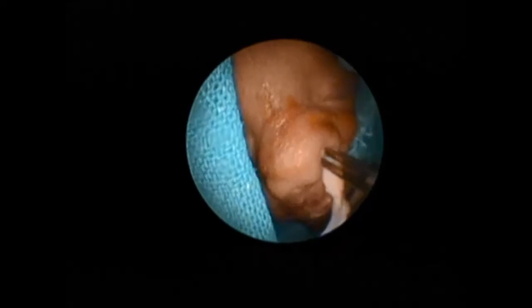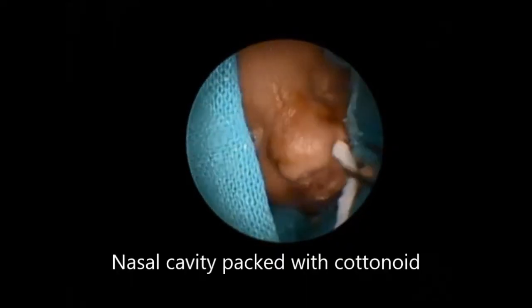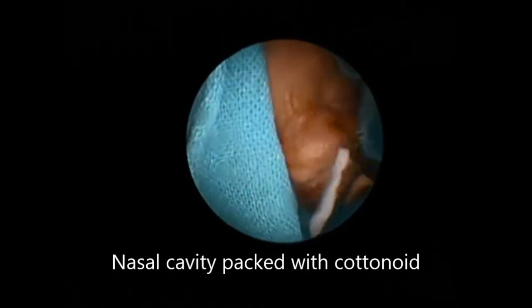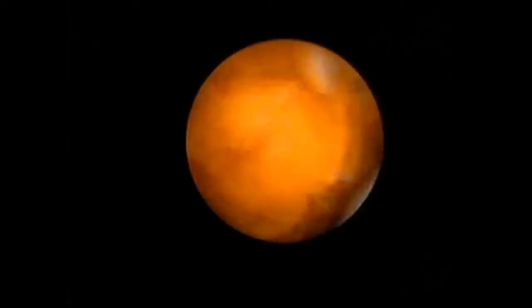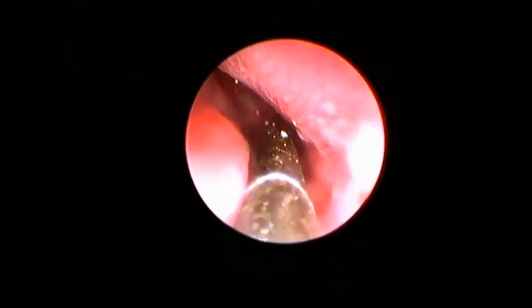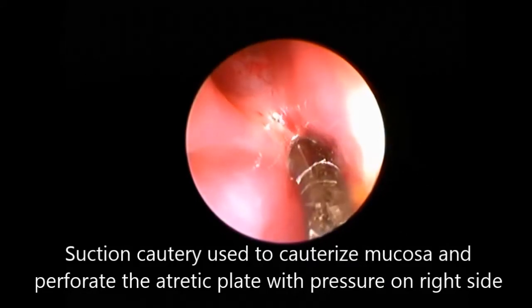Finally, the perforation was dilated. Intermittently, medicated ribbon gauze or neurosurgical patties were placed so as to achieve hemostasis.